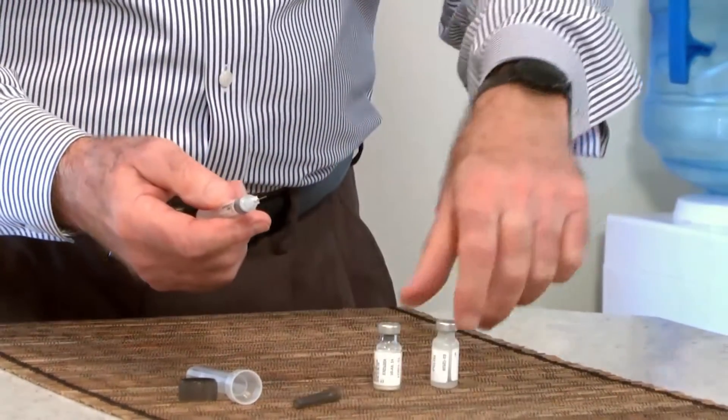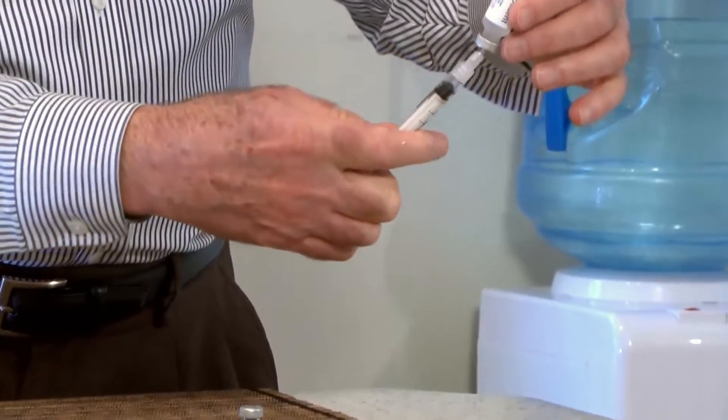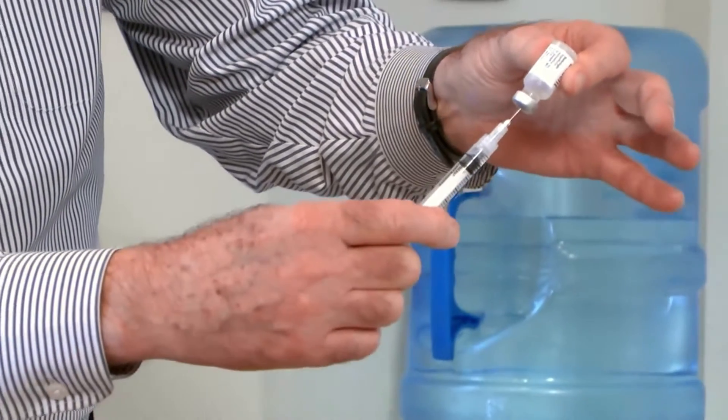Next, insert the needle into the rubber stopper of the liquid diluent bottle and pull back on the plunger to withdraw all the contents into the syringe.